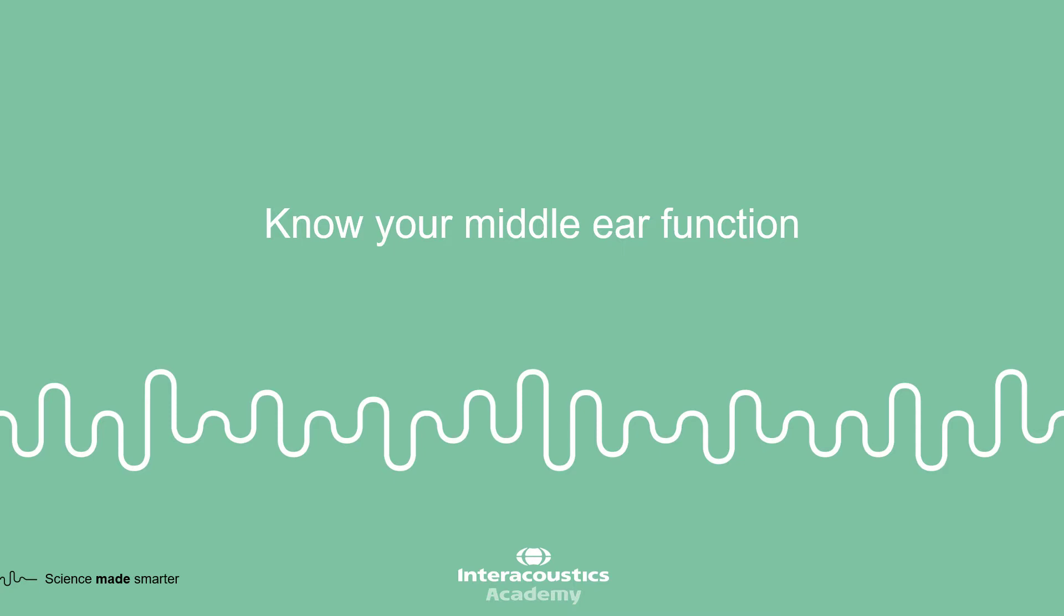This video tutorial is designed to guide you through some key aspects of wideband tympanometry that are important for undertaking a differential diagnosis.